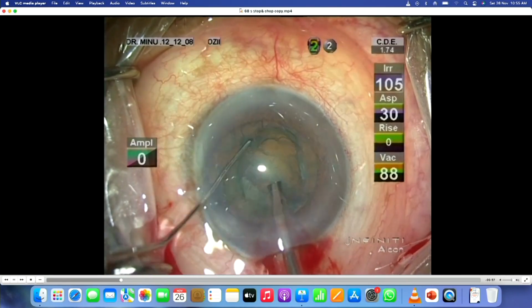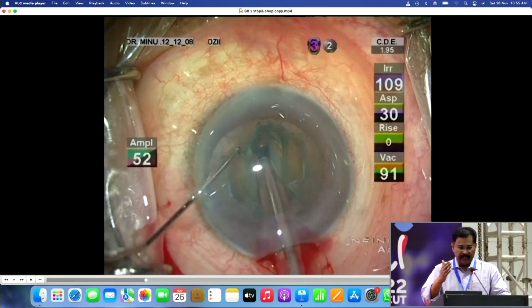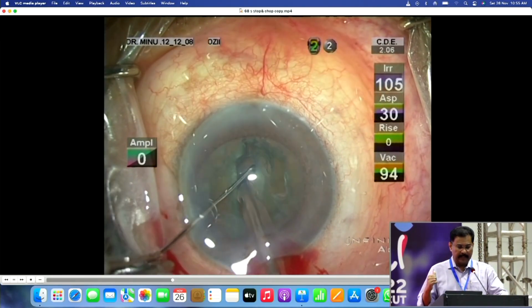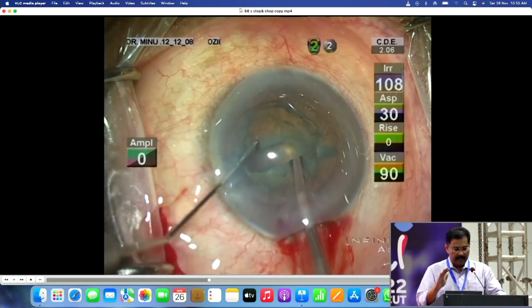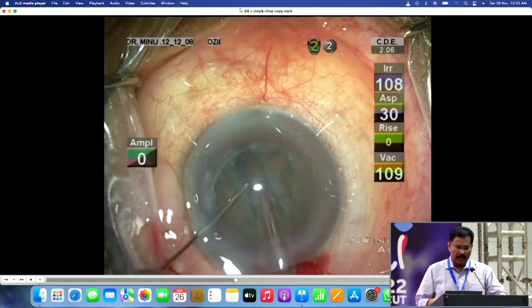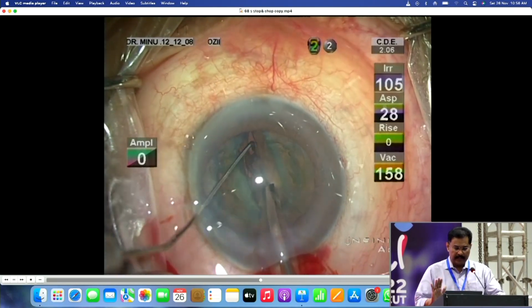These are the two advantages of doing partial trenching and partial chopping. So I finished the initial trench well, deep enough so you can see the red glow brightening there, using two instruments at the base of the trench and separating. So one half is separated, I rotate. I don't insist on going back and doing it in the same shot. So make sure the central part separates well. So nicely it is separated.